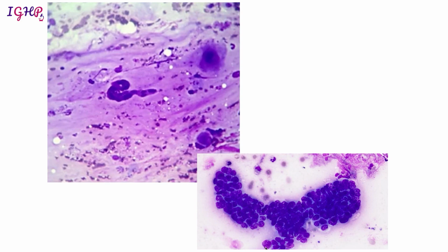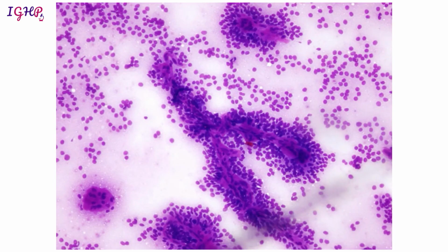At places the membrane looks irregular, so these are definitely showing some atypical changes. So these are atypical papilloid fragments, and together with the mucinous material in the background, we are going to think along the lines of an IPMN, that is intraductal papillary mucinous neoplasm. So this again will fit into a category 4, that is neoplastic and IPMN type, and depending upon the grades of dysplasia, we can call it either low grade or high grade dysplasia.